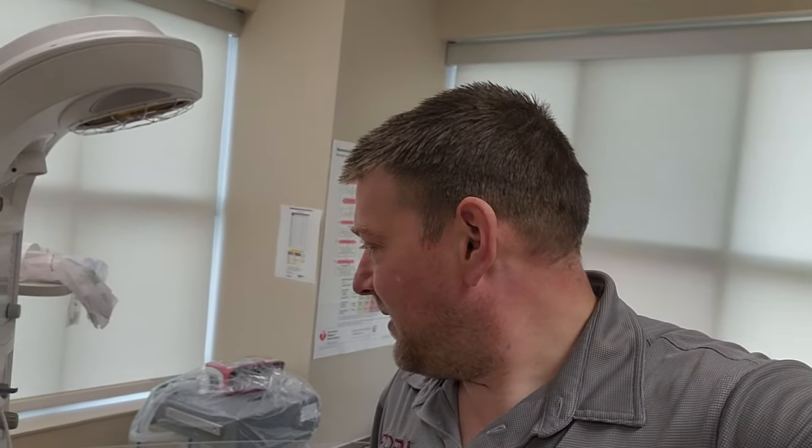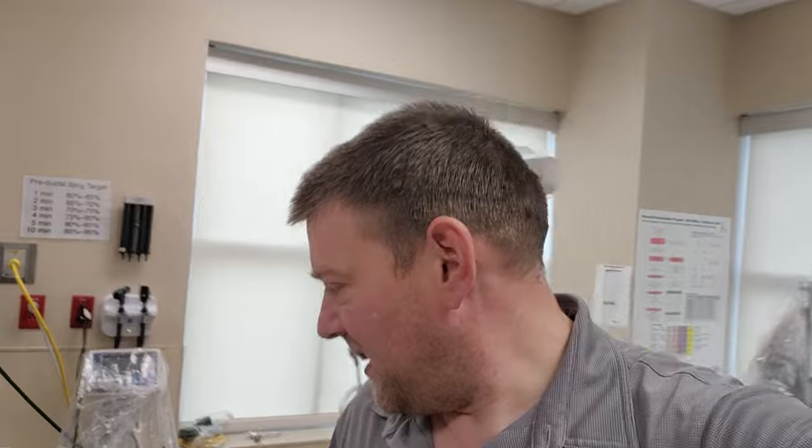But yeah, it's just one of those things, guys. It's a coin cell battery, super easy. Just change them out every 2 years, maybe change them out every year. They're really not that expensive. I mean, let's say $8 to $10 for a battery. Even these Energizers, which is what I use, are fairly inexpensive. Let's say it's $8 or $9 for a battery. Who cares, right? Considering the safety net that it provides. So guys, every 2 years, change out the coin cell battery and rebuild your blenders, okay?